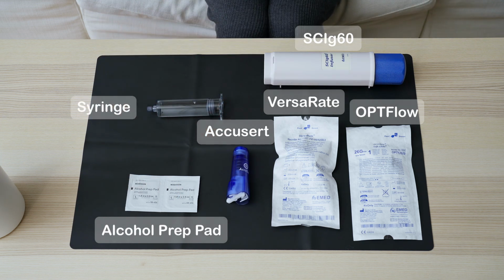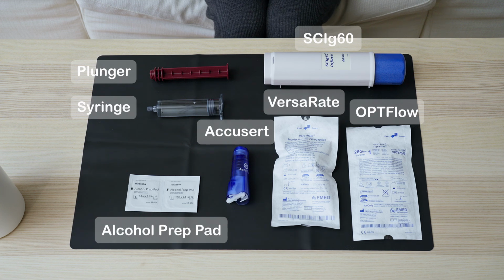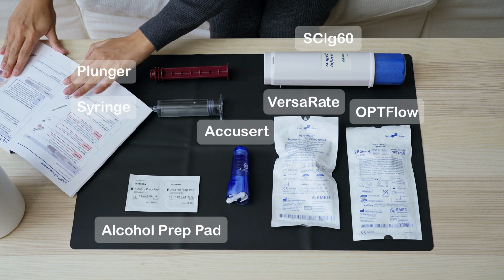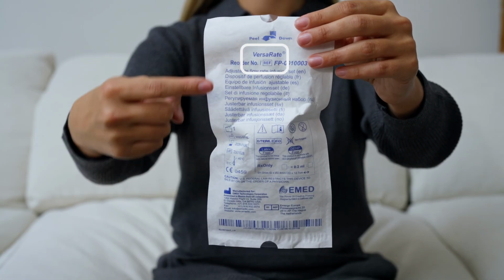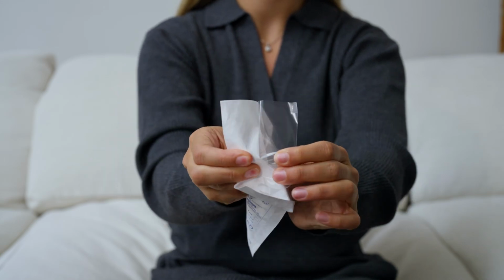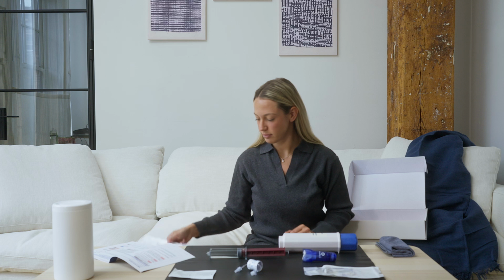Prior to administration, verify you are using the correct VersaRate flow rate controller, OptiFlow needle set, and syringe prescribed by your healthcare professional. Verify the expiration date and ensure the sterile packaging is not damaged. Please read and follow all instructions for the indicated fluid and components prior to use.